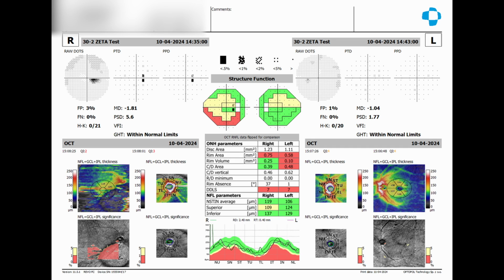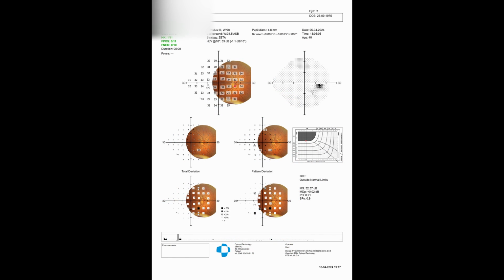A minor issue is the blue light. I think it's a nice feature, no doubts about that, having this background illumination that allows patients to see slightly in otherwise dark environment. It's a nice feature, but usually we have our visual fields next to pentacam because they both require darkness. Here, this wouldn't be possible. You cannot have pentacam next to something that emits blue light. But on the other side, patients really like this feature.